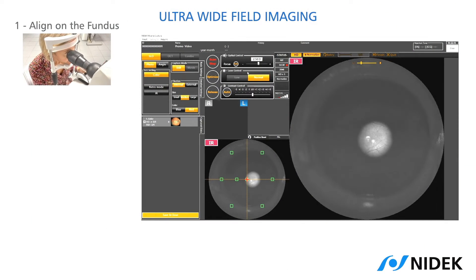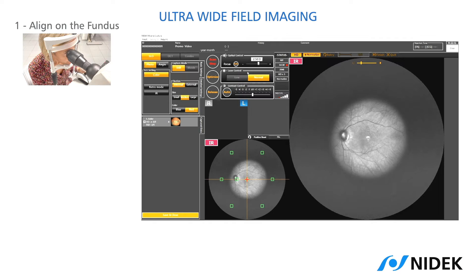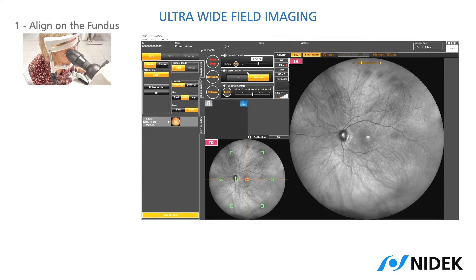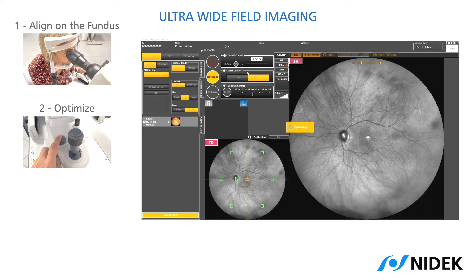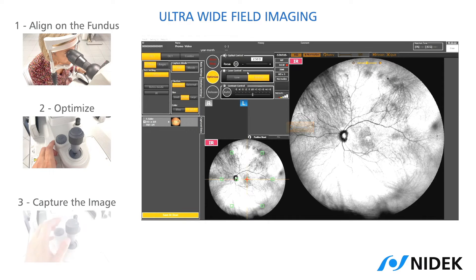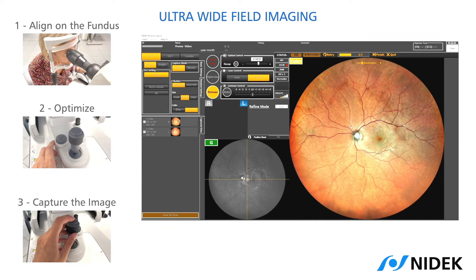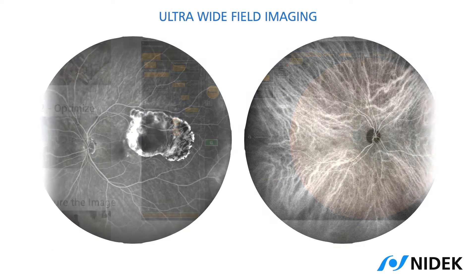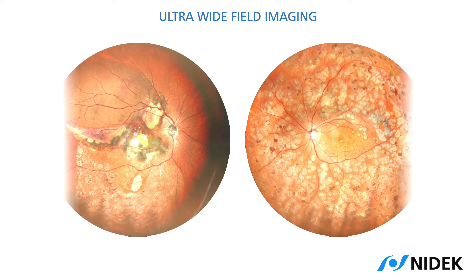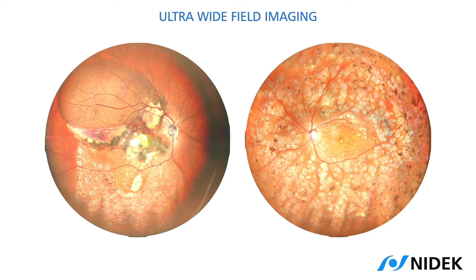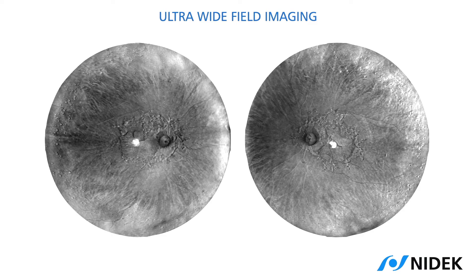As the attachable ultra-wide field lens is more protrudent, one trick to avoid touching the patient is to swing temporarily and tilt inferiorly the optical head. We can then proceed with the optimization of the fundus pictures and the capture. In this very same way, we can also take ultra-wide field fluorescein and indocyanine angiographies, ultra-wide field color images and ultra-wide field retro mode images.